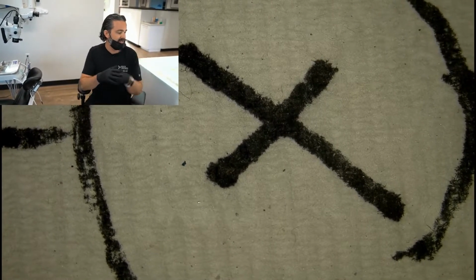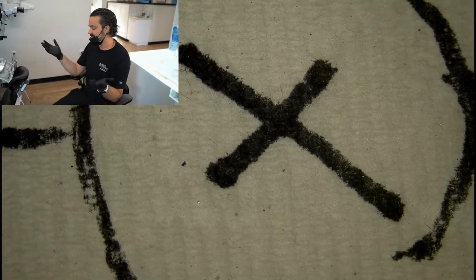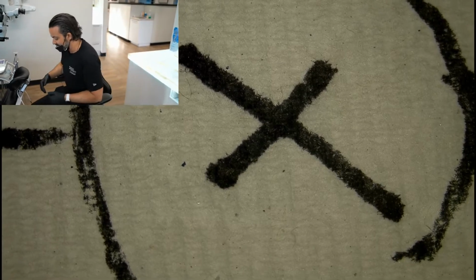Now, examinations. Let's go back to examinations. Let's actually do an examination and see the power of a microscope. So, Lindsay, let's get back into position.